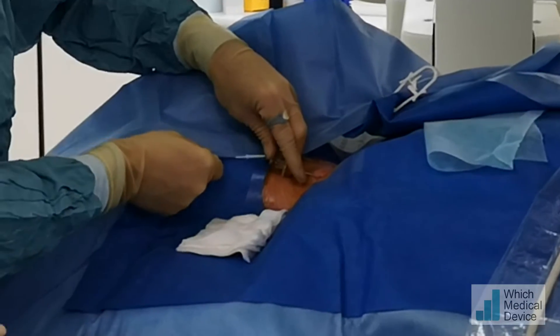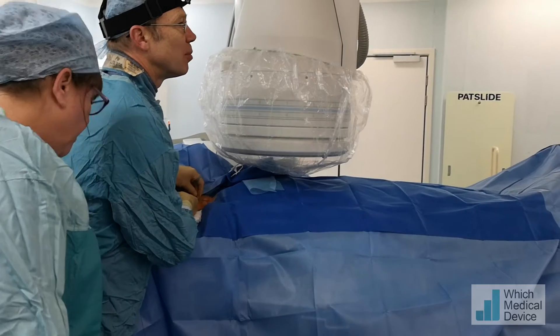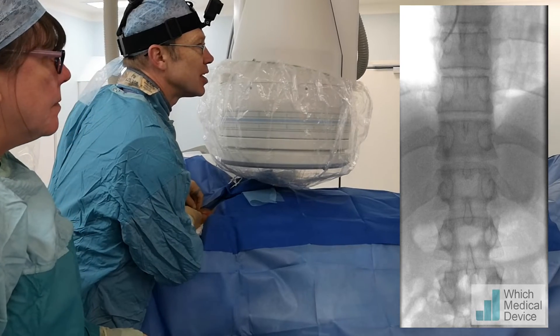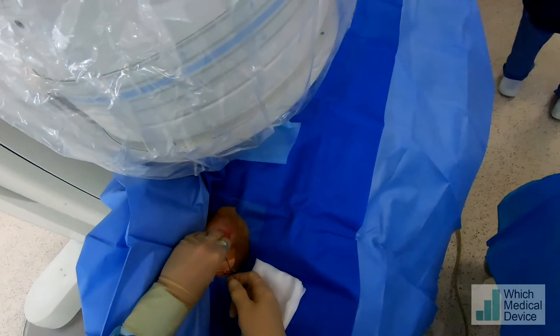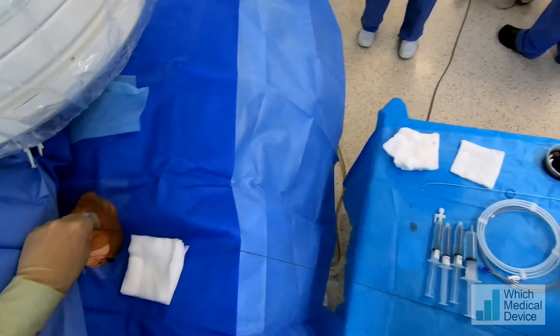I'm just going to pass this guide wire down. Just take a breath in for me now, please — that straightens out the IVC and often allows us to pass the wire down. Okay, we'll put the sheath in now. A bit of pulling and pushing — we're just going to pop a five-french sheath on that.